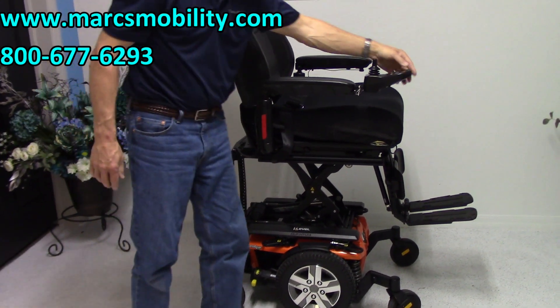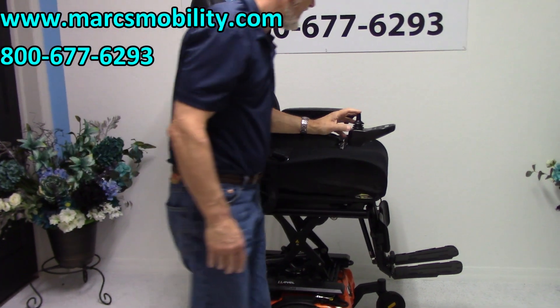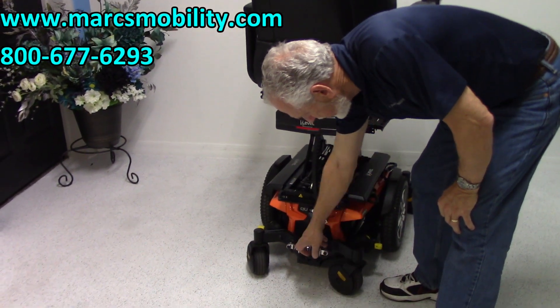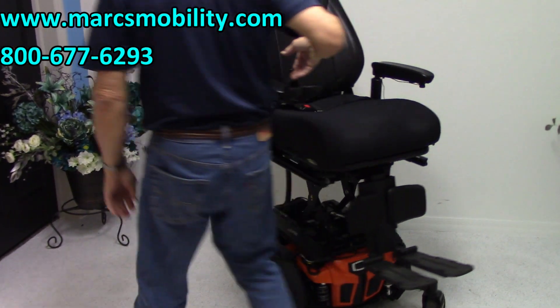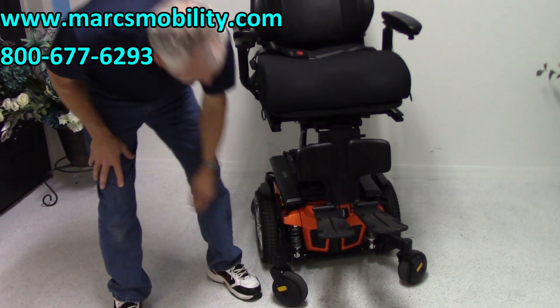I'm going to show you the suspension also on this chair. If you look at the back, you can see the suspension in the back right here for these two forks — adjustable suspension. And you have the same suspension in the front: you have one here and you have one over there. You have two suspension points.